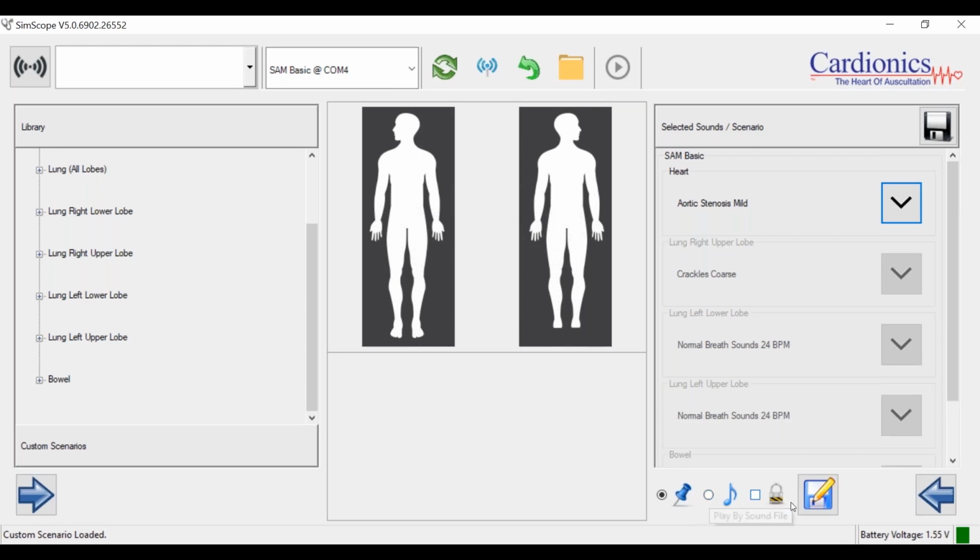And then the third icon that you have here is for locking. It's a padlock sign. So you can lock the site. And this is important for students, for example, if you want to freeze the sounds. So if you click on this, some of the things would be blended out for them. So you can switch off verification mode. So they will not get any verification of the sounds. They just learn the sounds and try to memorize what the sounds are all about.